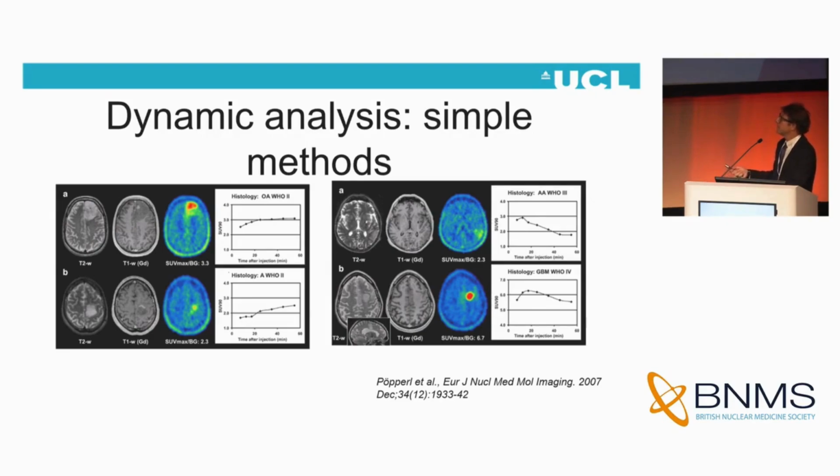The simple visual evaluation, I think, is already enough, just looking at the behavior of the curve. In this case, to do a simple analysis, you can plot the SUV max of the tumor on the same plane during the different frames and build this type of curve.